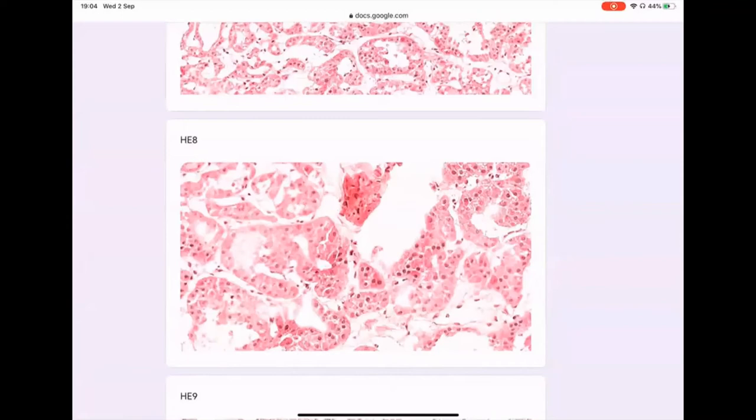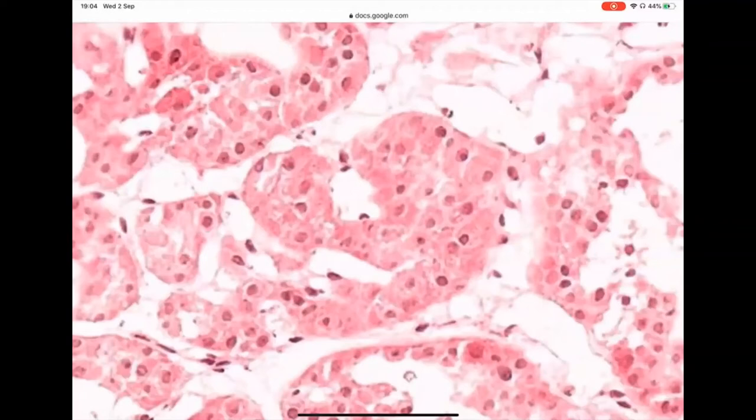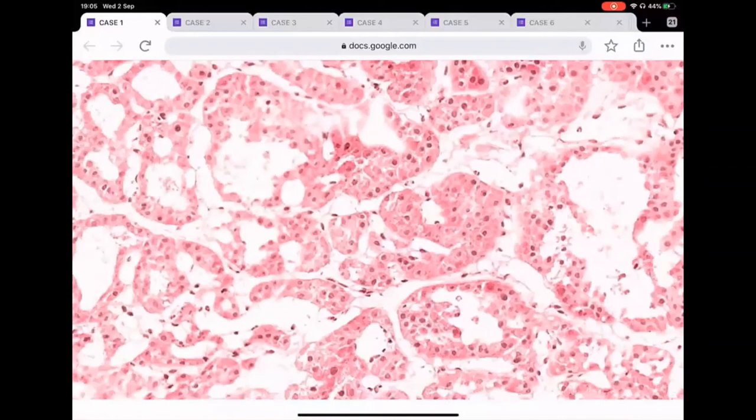The second one is the chromophobe, and you definitely have to consider it. And you know that in real life, sometimes it's even difficult to differentiate the chromophobe from oncocytoma. In some types of tumor, you have a hybrid. You have the chromophobe and the oncocytoma sitting next to each other, which we call a hybrid tumor. And then the third one is, of course, the oncocytoma, which is important. But yes, the edematous or slightly myxoid stroma will go.